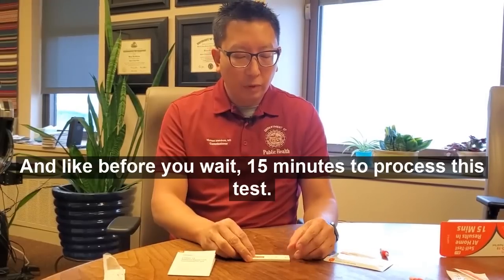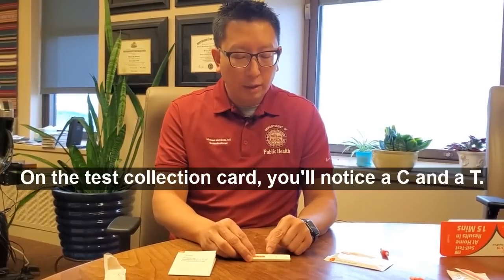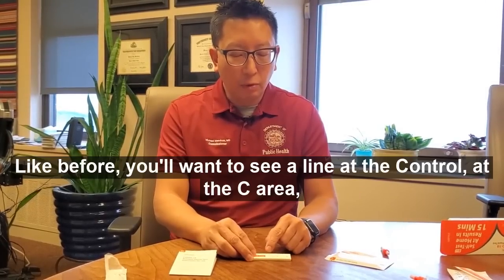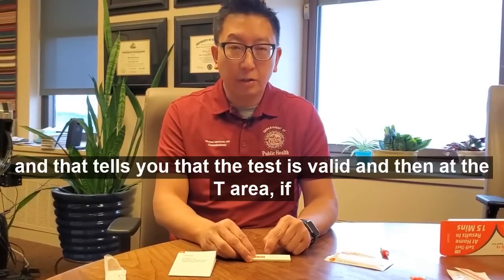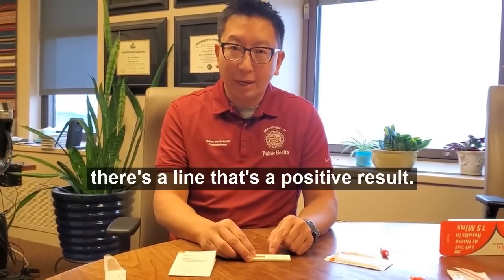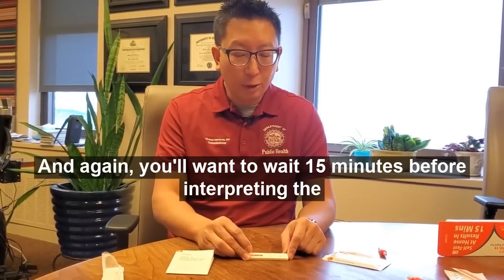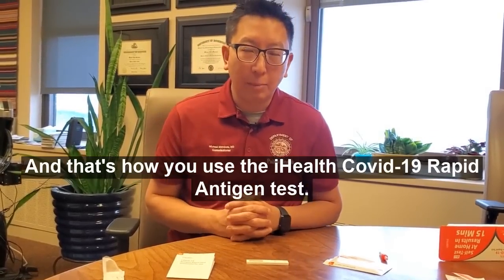Wait 15 minutes to process this test. On the test card, you'll notice a C and a T. The C stands for control and the T stands for test. You'll want to see a line at the C area, which tells you that the test is valid. At the T area, if there's a line, that's a positive result, and if there's no line, that means it's a negative result. Wait 15 minutes before interpreting the results. And that's how you use the iHealth COVID-19 Rapid Antigen Test.